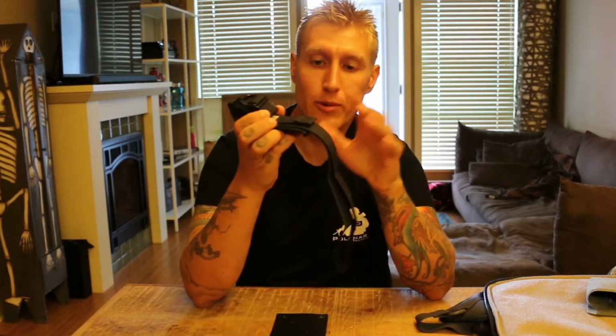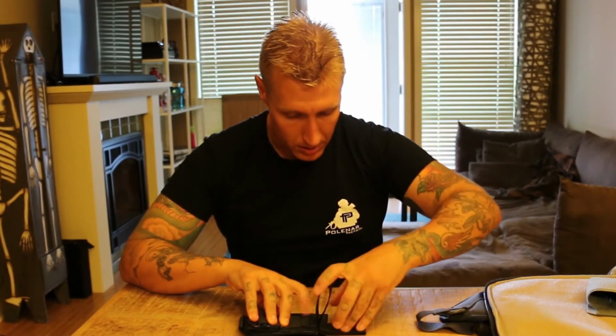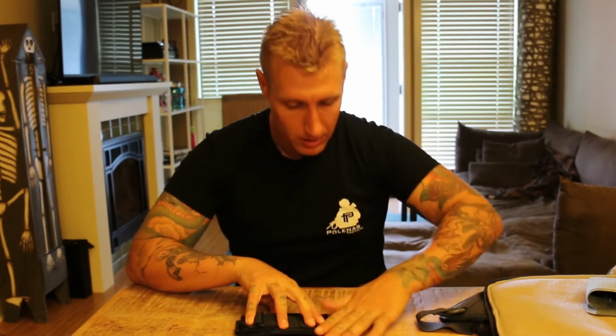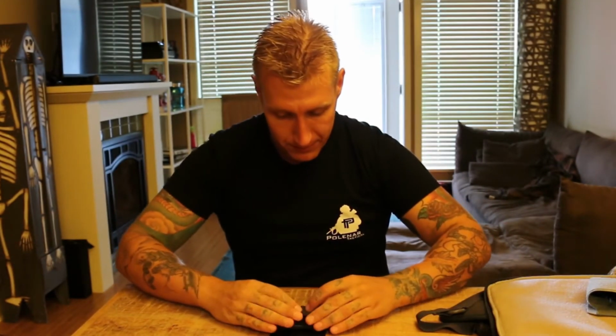The next step I'm going to do is, with all this extra webbing, I want to take it, fold it over, and have it running in this section of the tourniquet here so that it's out of the way. So the method that I did for this was a tri-fold, Z-fold method. I found it was easier for me if I set it down on a table, and all I'm going to do is fold it over so that it touches the wide part of the tourniquet, and I fold it back. This gives me my Z-fold here. Once that's done, I can fold it back over the tourniquet.